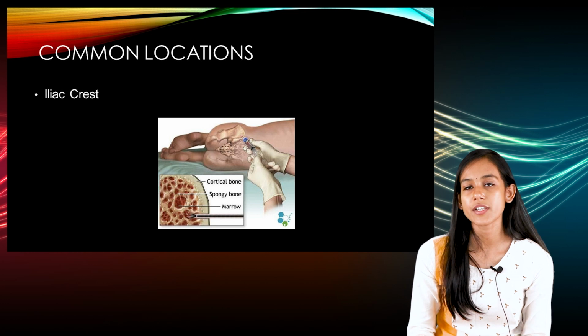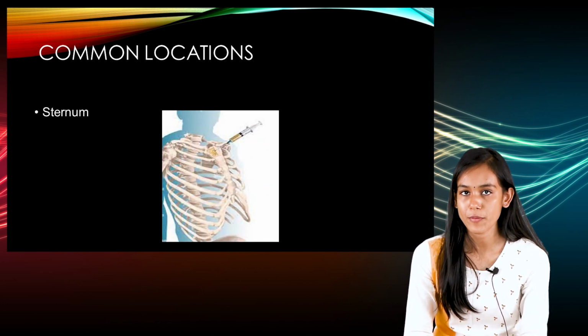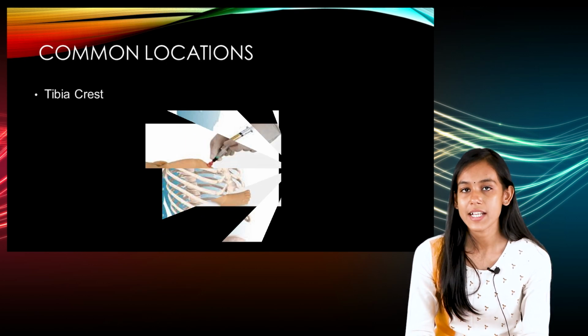We can use the posterior superior part of the iliac crest, and then from the sternum also we can collect bone marrow, and the last one is the tibial crest.